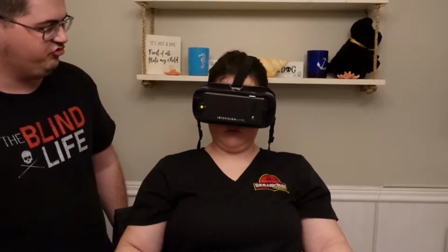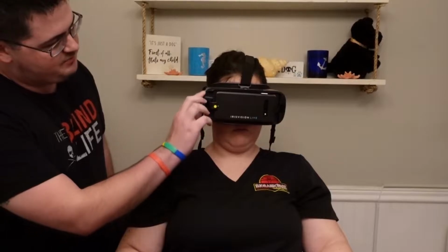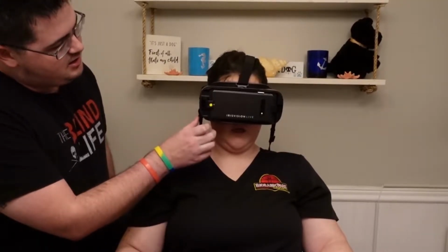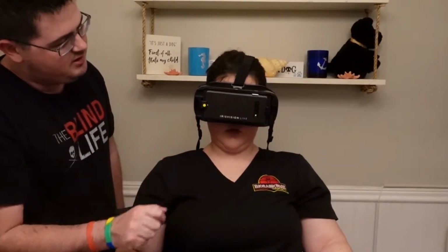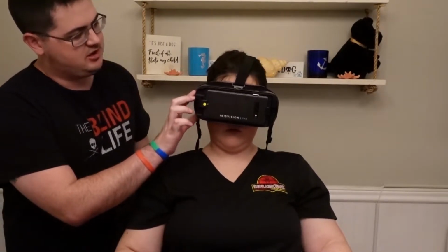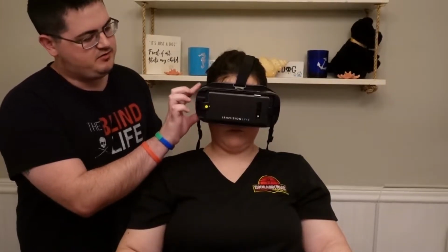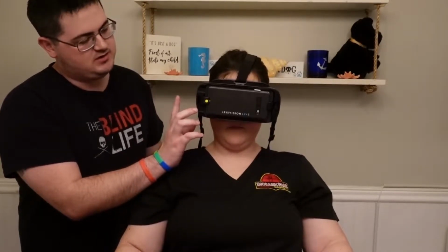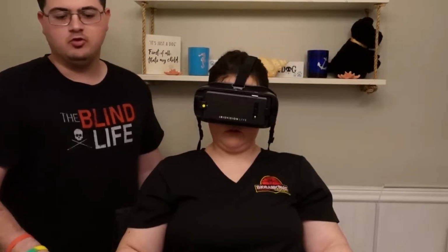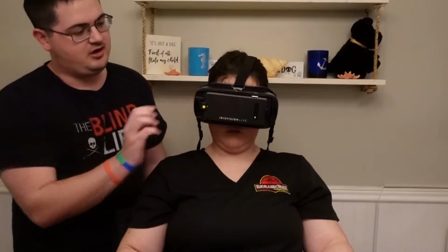And we're going to start, I think, with the focus, which is pretty much how you start off with the goggles. Basically, how this works is that there is a phone strapped into this VR headset. It has a phone, and the phone is acting as the camera. There are buttons on the side of the device. One button changes the modes, the other does a snapshot, and then of course there's a pad that you can tap and do voice commands with. We'll get into those a little bit later. But basically, it starts off on focus.